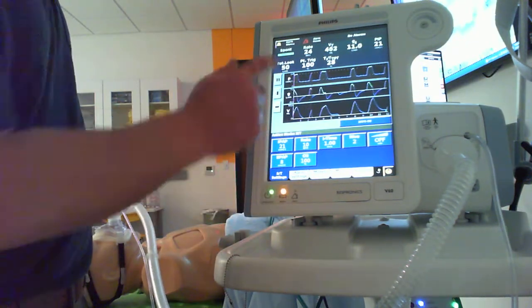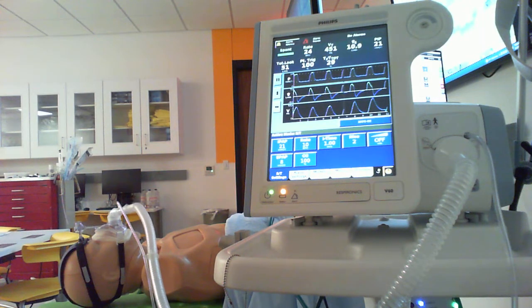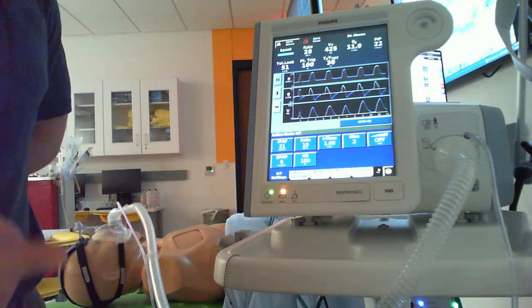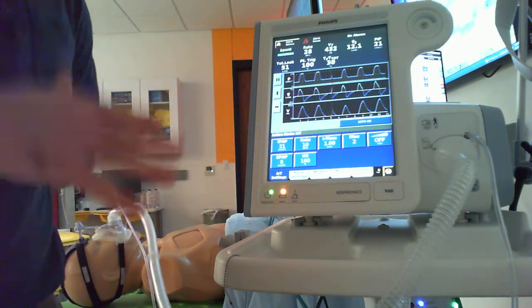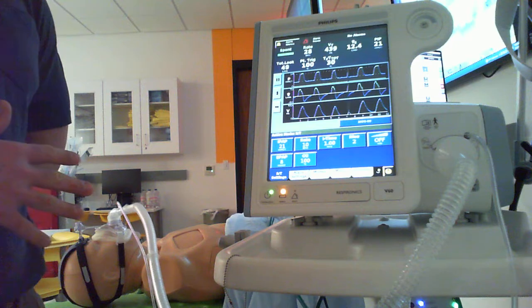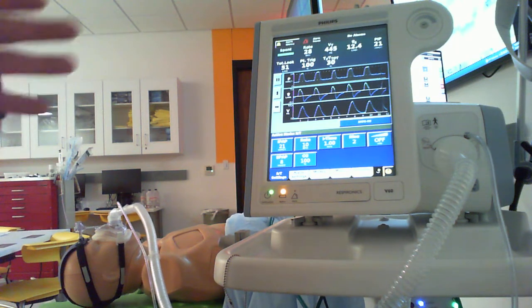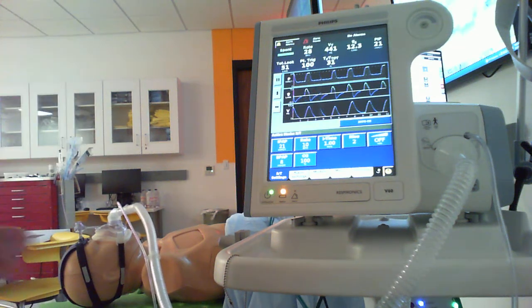Once again, if you want to get a blood gas afterwards, that's totally fine, but we should be seeing signs of improvement. All right, things to be cautious about: patients you can't get off 100% oxygen, worsening mental status, inability to get their respiratory rate down despite good volumes. Patients that are becoming combative, somebody losing the ability to protect their airway, all those different things would be recommendations to consider possible intubation.